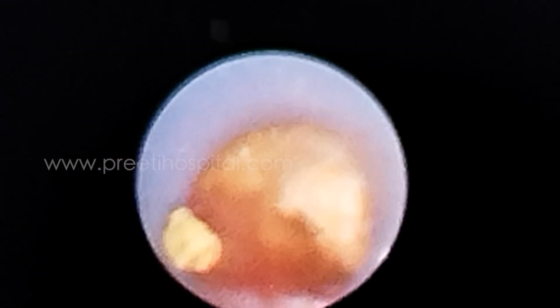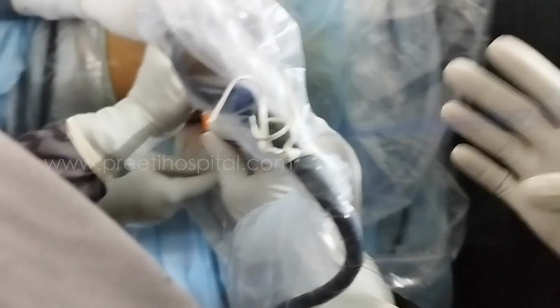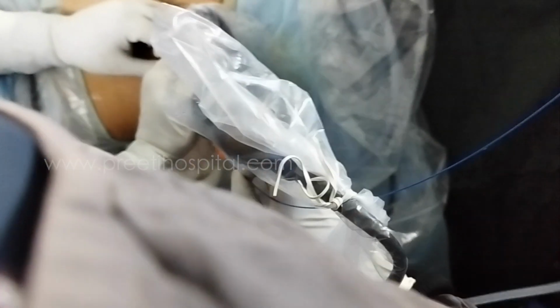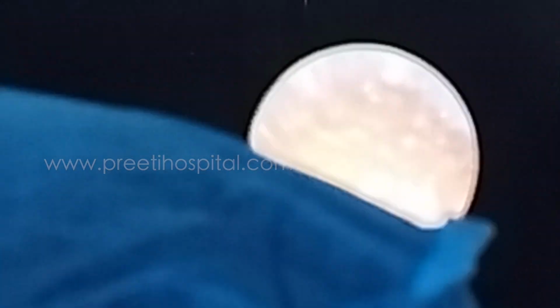Sometimes, most of the times, you don't require forceps. Do you have the laser? Yes. Laser, you should use a 500 or 600 micron fiber and make holes. This is possible with thulium fiber. People say it is not a fragmenting laser. Why? It will make a nice drill. What is the aim? See, finished.